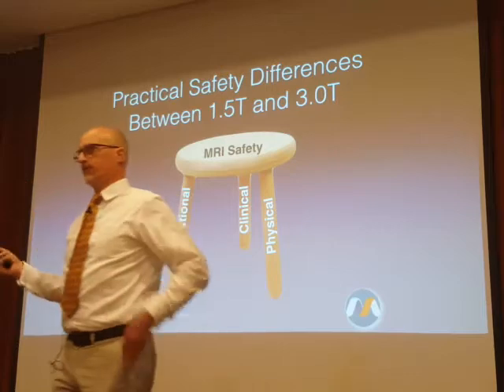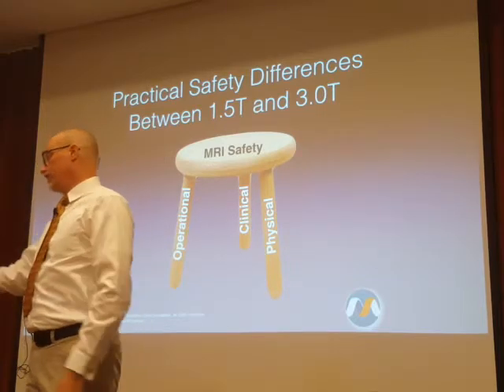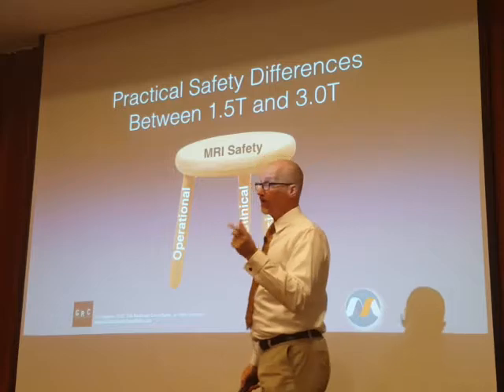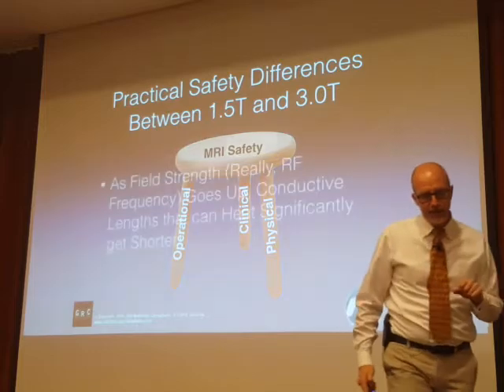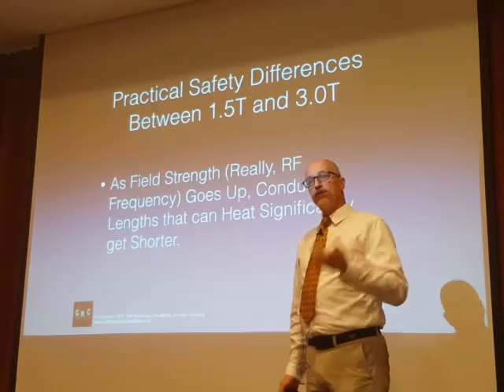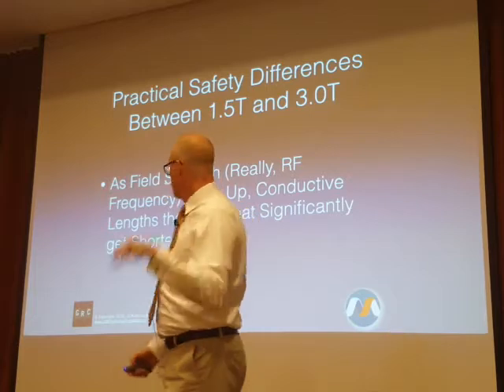And particularly, other than the overt MR conditional labels that say, yes, it's okay at 1.5, but no, not at 3, the thing that we're worried about is the difference in length of an electrically conductive material and its potential for resonant circuit heating. As I mentioned, as the field strength increases, frequency increases, which means wavelength gets smaller, which means the length of the object that we're concerned about gets smaller.